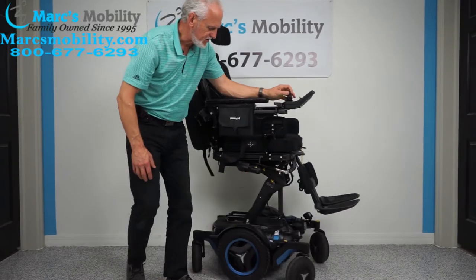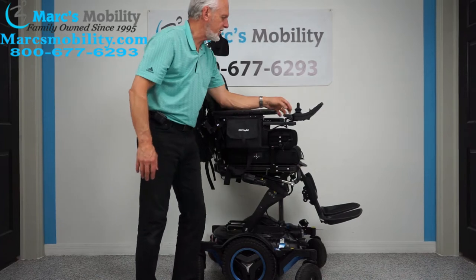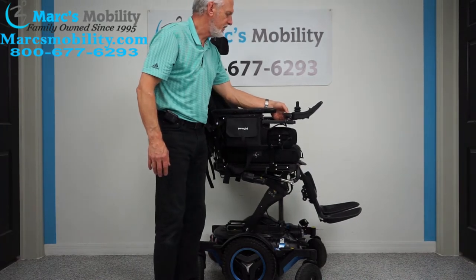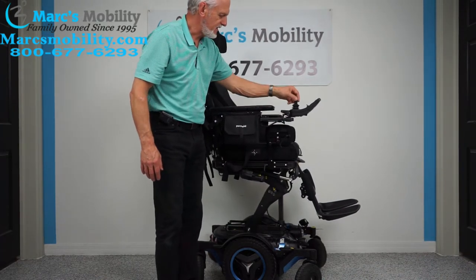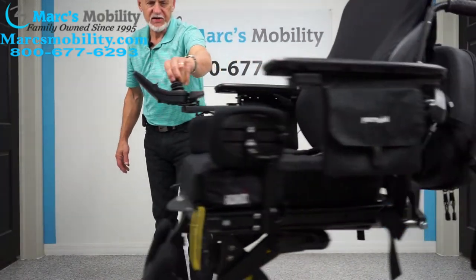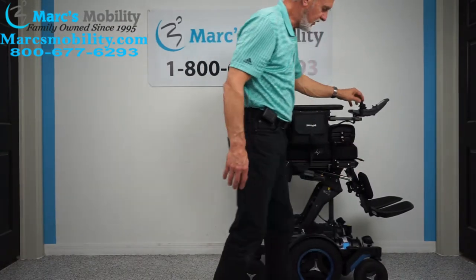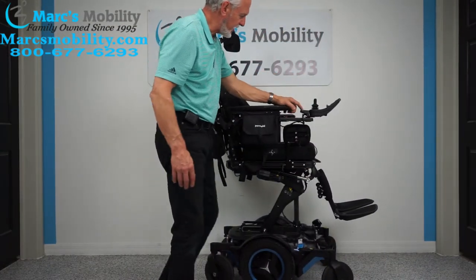One more thing to note: when the seat is elevated, the chair will still drive at speed. You can see it really moves even with the seat elevated. So with the seat elevated, you can still drive it.